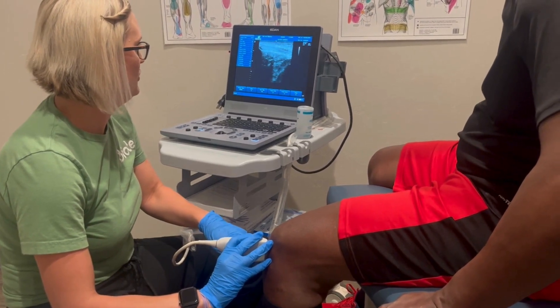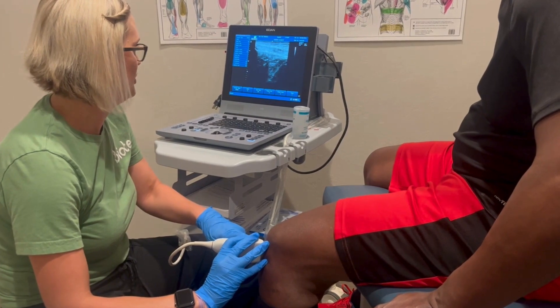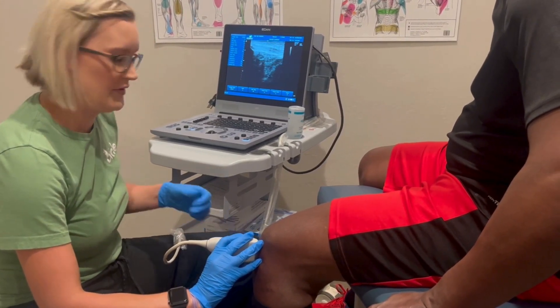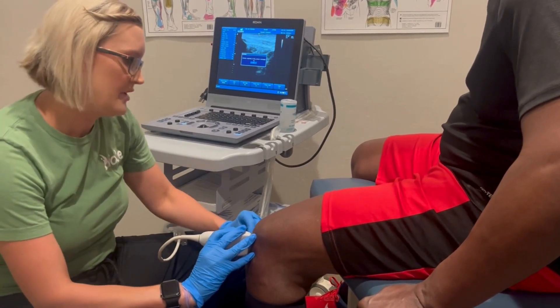Finding where I need to be, kind of pushing — okay, there's my soft tissue right there. I mark with my fingernail, so I'm sorry, I know that doesn't feel great. And then what I do is I clean your knee off.